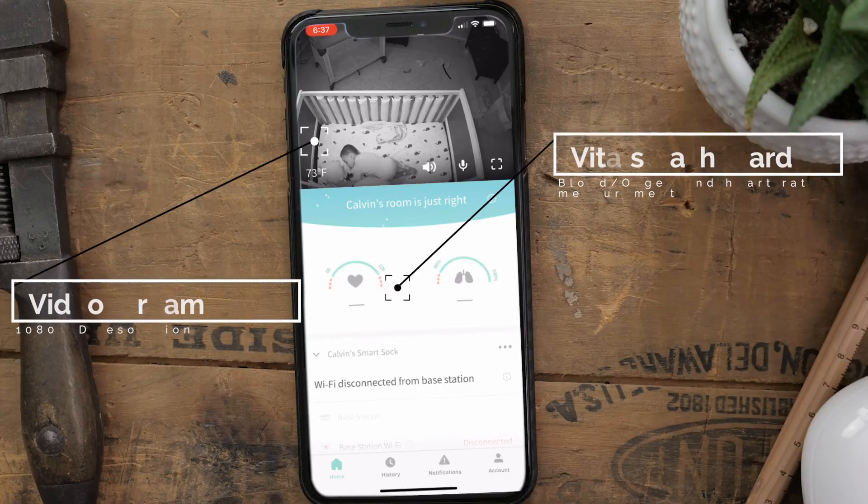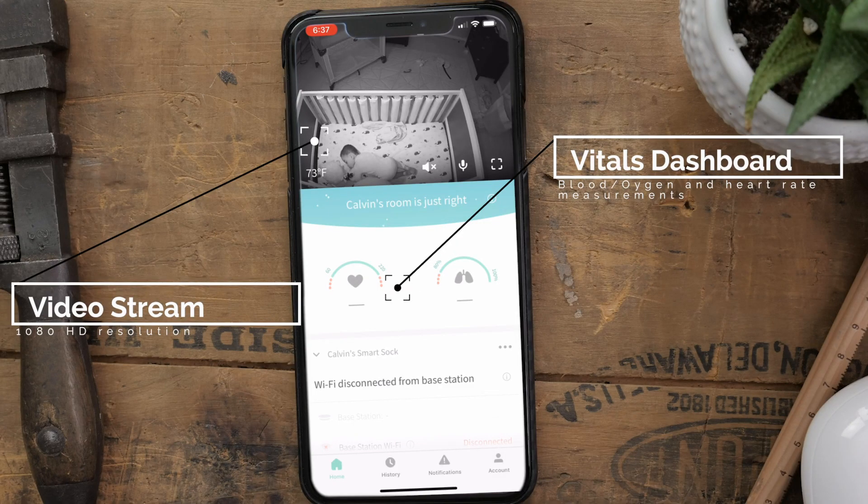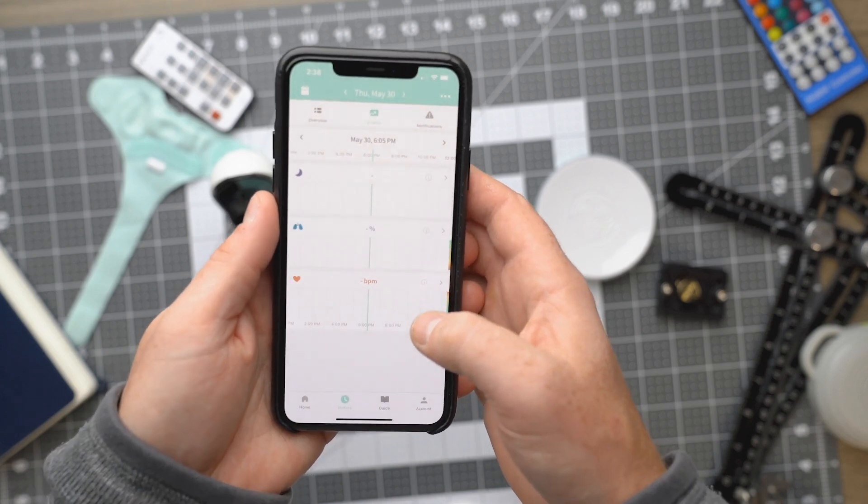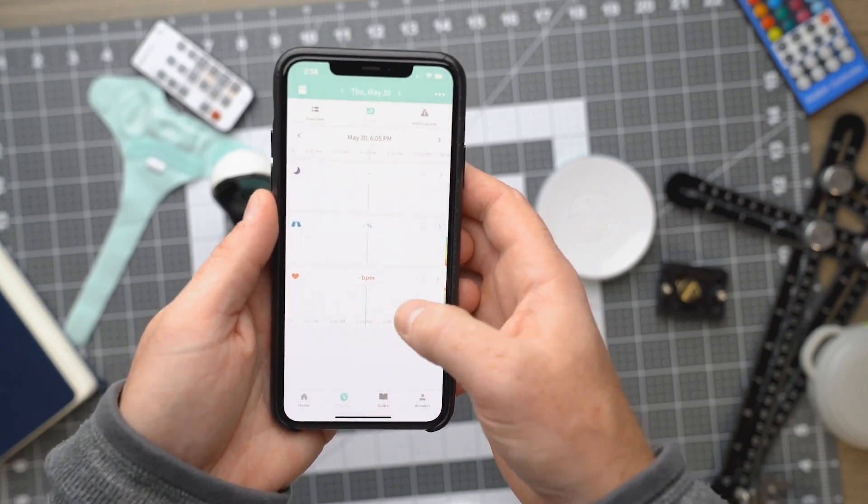Moving on to the app — you can easily monitor heart rate and oxygen levels from the main screen of the app. If you have the Owlette Cam, you can use the app to view the video stream of your baby as well. There's also a section within the app that displays trends and historical data, including sleep and awake periods, which is super important even well beyond the infant stage.